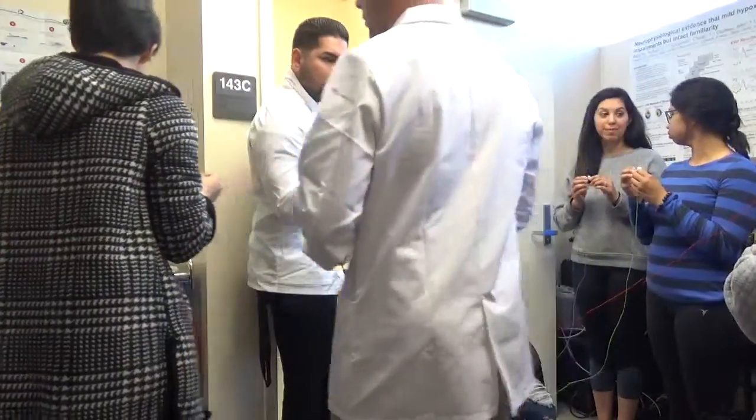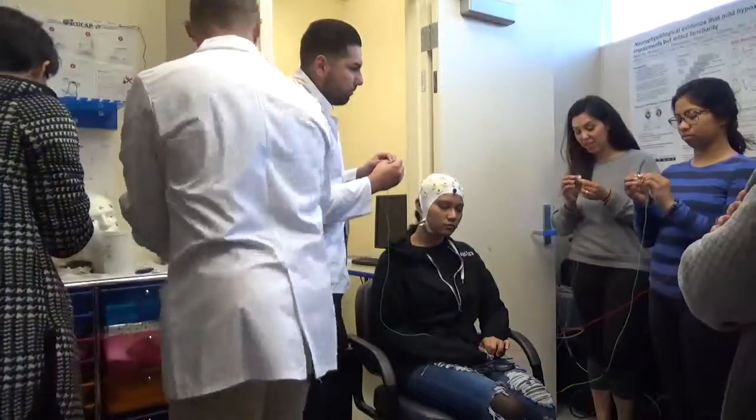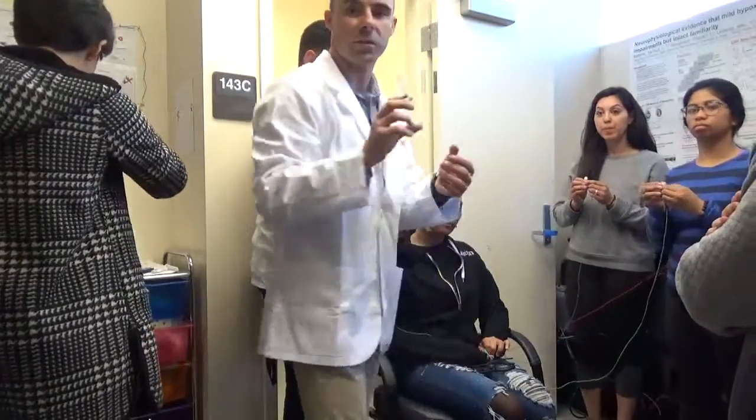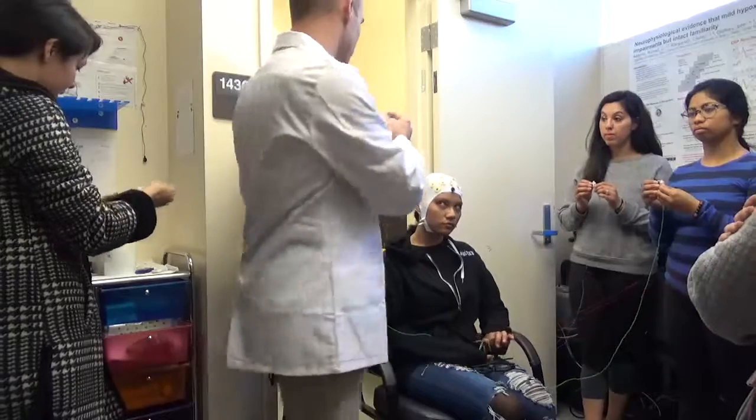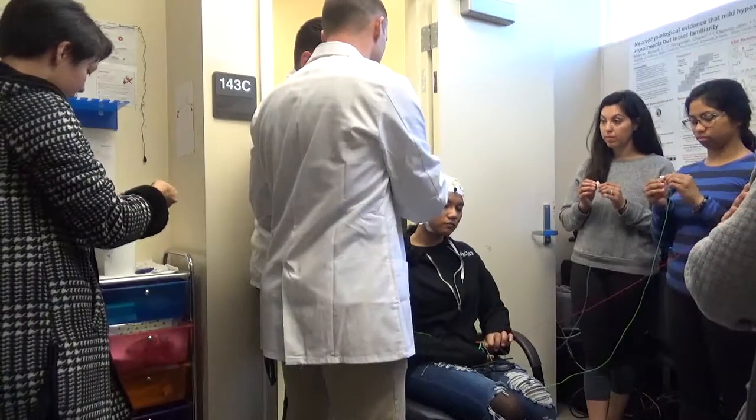Oh, we should show them how to do it right. Okay, so what you're going to do is, before you tape it on, you're going to take a little bit of gel and just literally dab a tiny little bit. Really not much is needed. That's it.